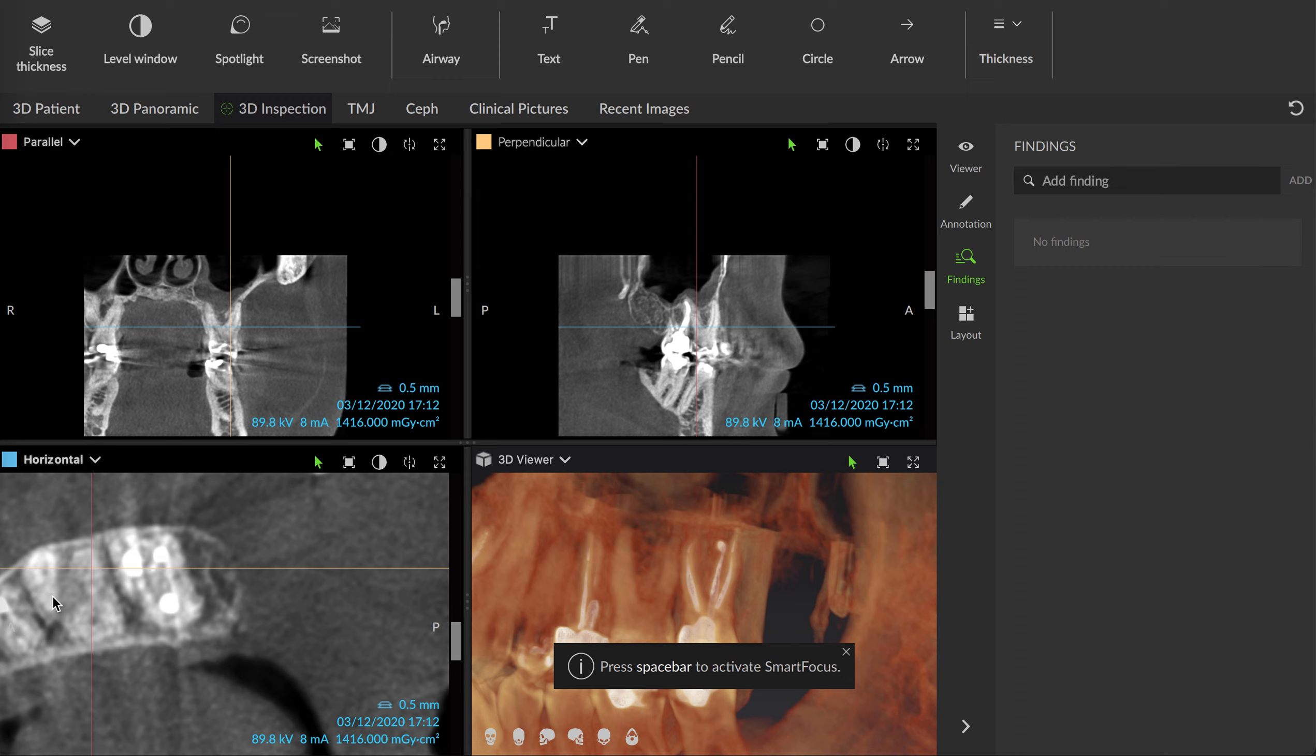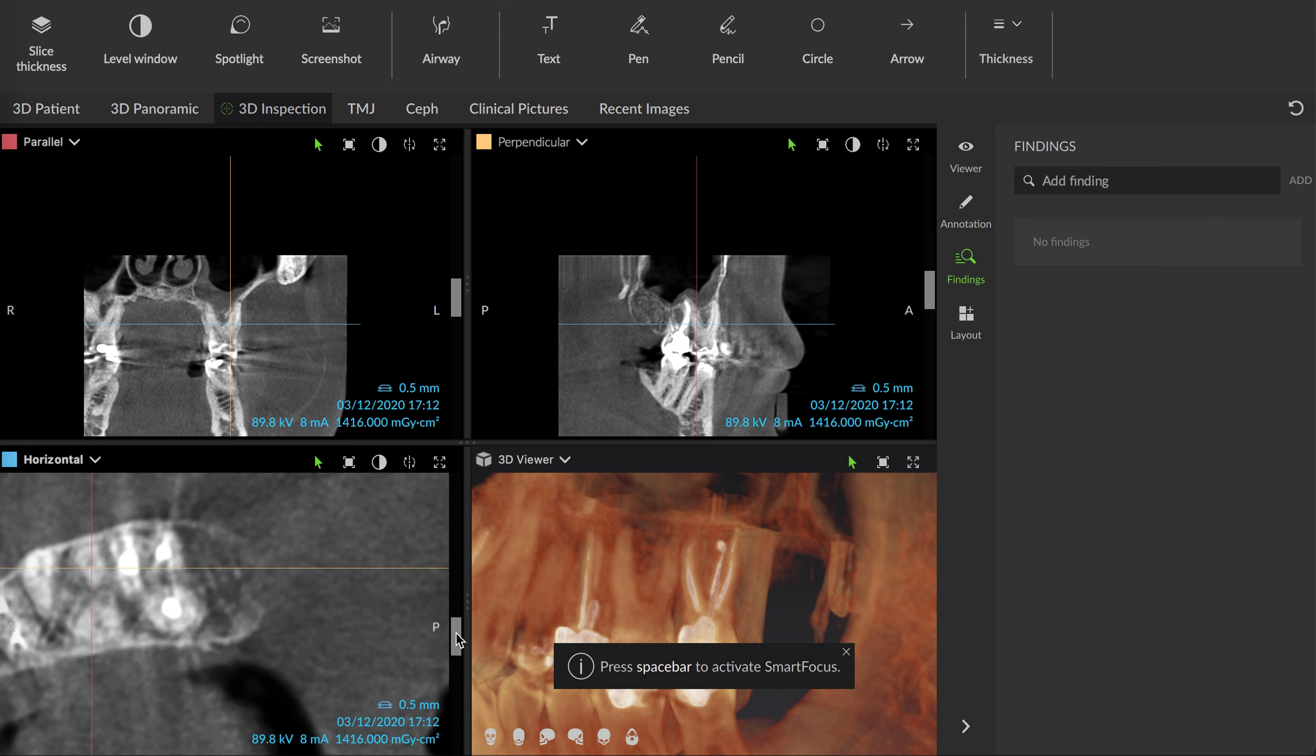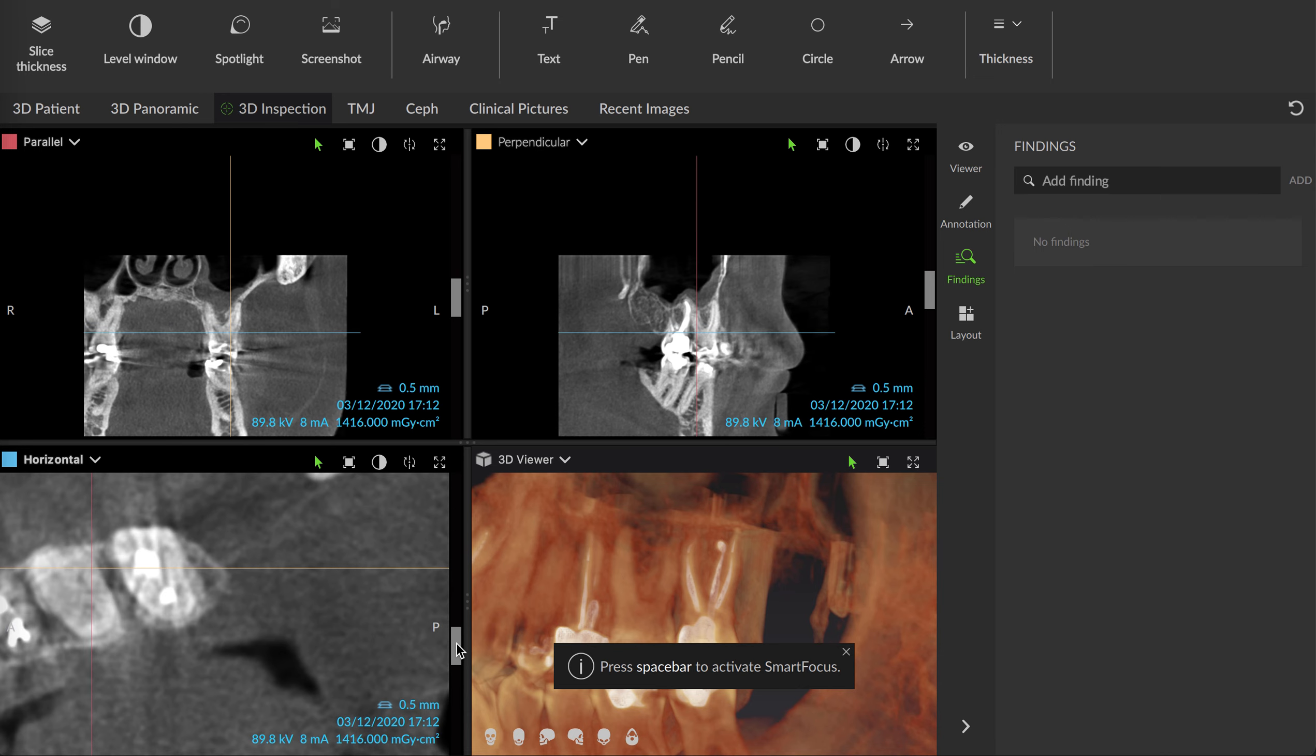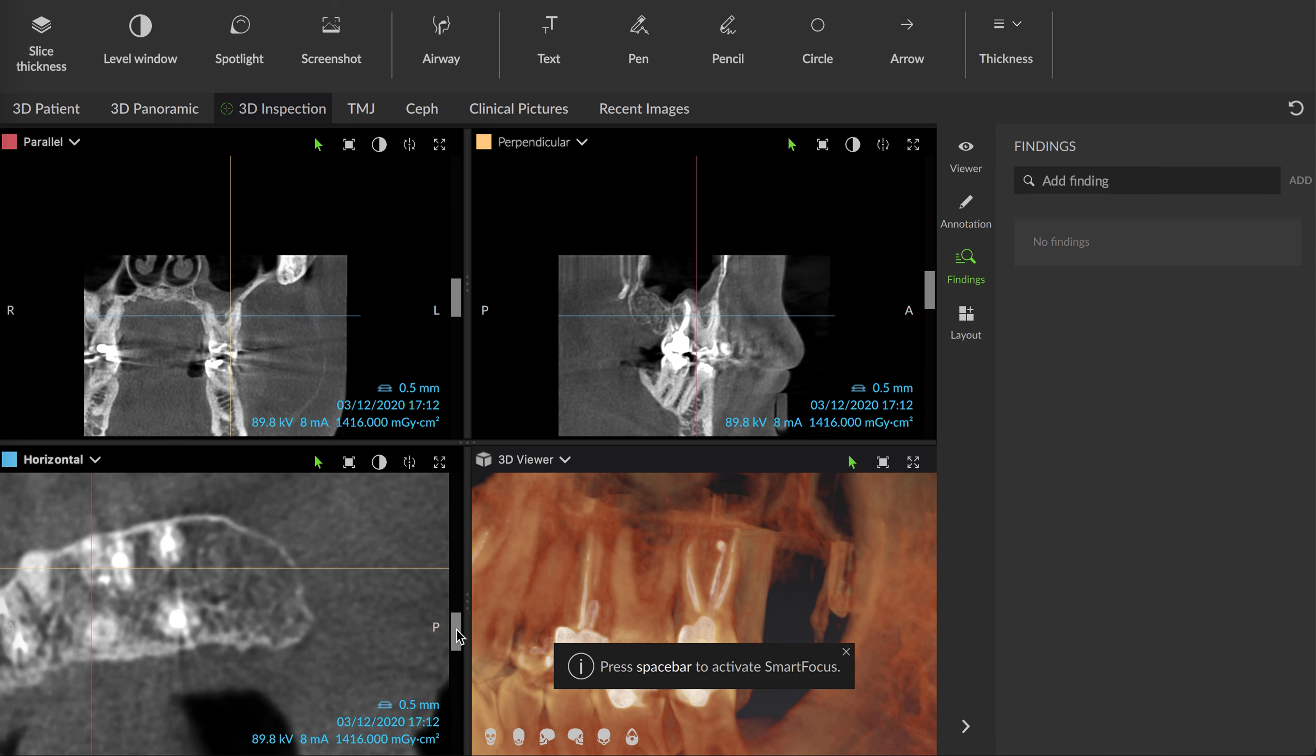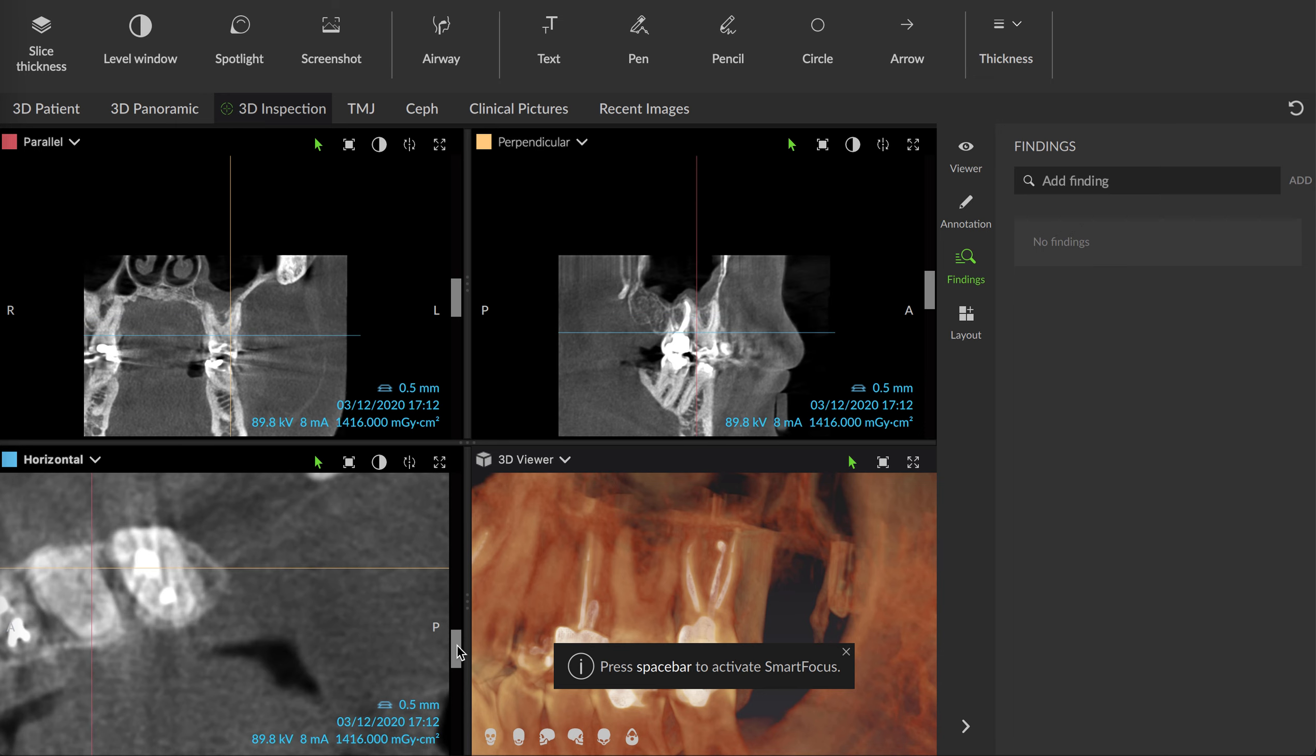There was no MB2, although it looks like there might be a little ghost of one. I could not find one and I'm not seeing anything really clearly in this x-ray. So distal buccal was found and obturated thanks to CBCT technology. What a great blessing.